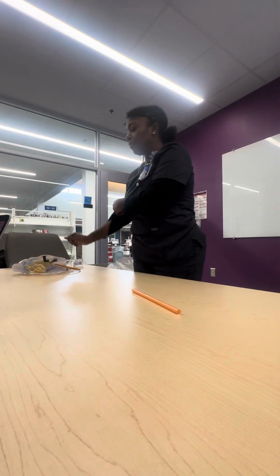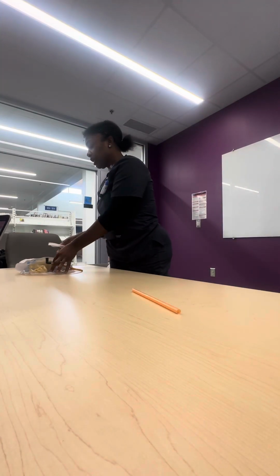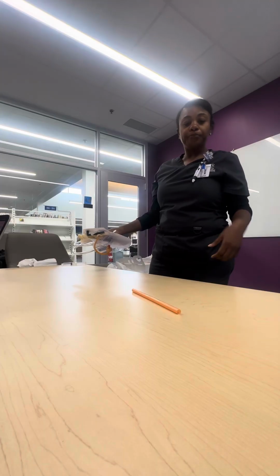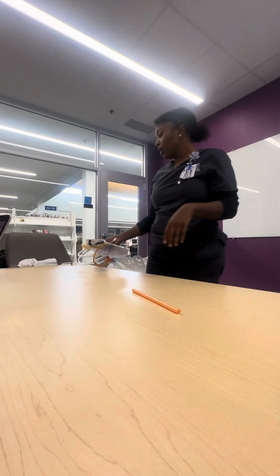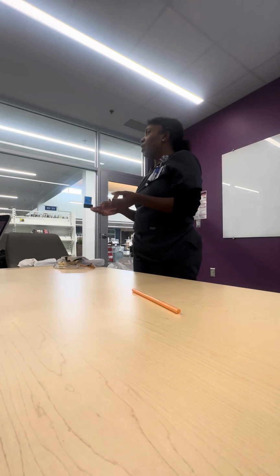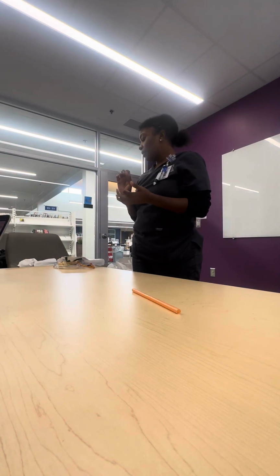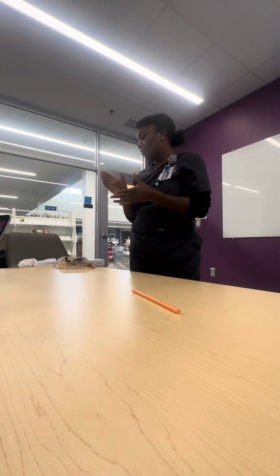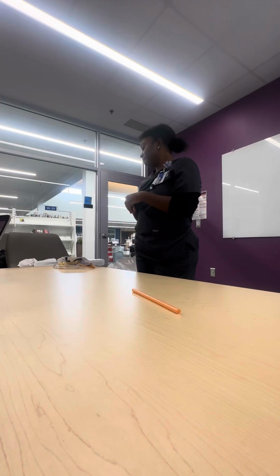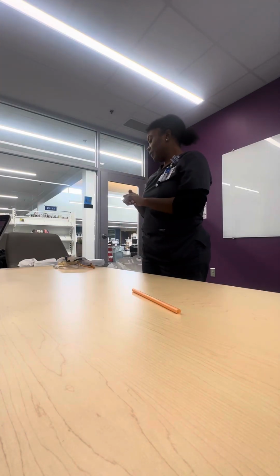I'm gonna take it off, put a linen back, lower the bed, ask my patient how they're feeling, do they need anything? Make sure the bed is lower. They have a call light, the rails are up, the bed is locked. And assess their pain and go ahead and document how much the output was, the color, the smell, and did I see any blood, and my patient assessment. And yeah, ask them do they want the door open or closed. And that's it.